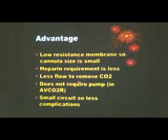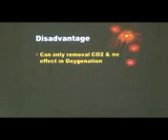Can anybody tell me why less flow is required to remove carbon dioxide? Faster diffusion. Yeah, it doesn't depend. In the gas exchange we discussed, carbon dioxide is usually a gas flow variable and oxygen is the blood flow variable. So you don't require a higher flow to remove the carbon dioxide. If less flow is there, that should be enough. What you require is more sweep gas flow to remove that much carbon dioxide. Obviously, this device can only take care of the carbon dioxide. If in a run you find oxygenation is again giving a problem, then you switch over to ECMO.